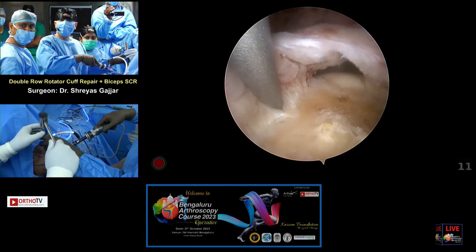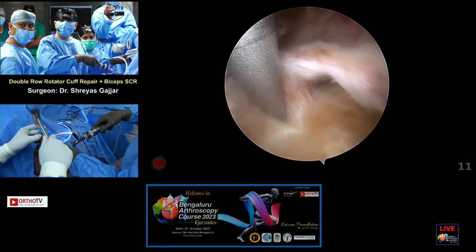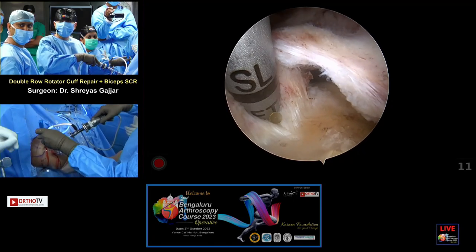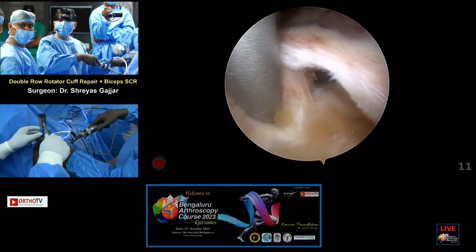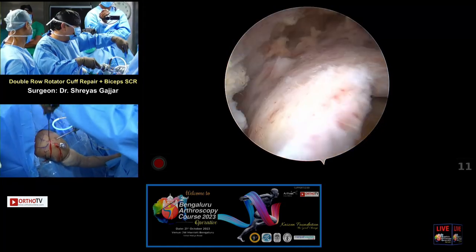Keep going slowly. Initially, a few taps to engage it, and then you can go hard, depending on the bone quality. Slow down, Akshay. As we are coming here, go down slowly. We have to bury the alphabets. Keep going. That's it, good. So the white one, sister, the white tape anchor.